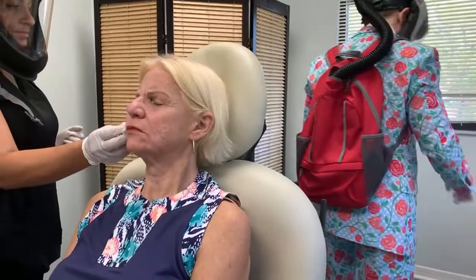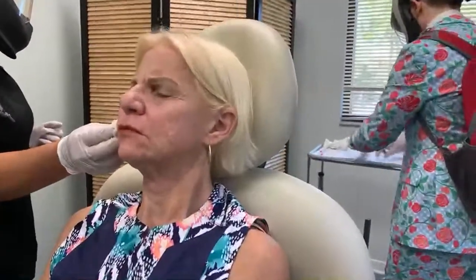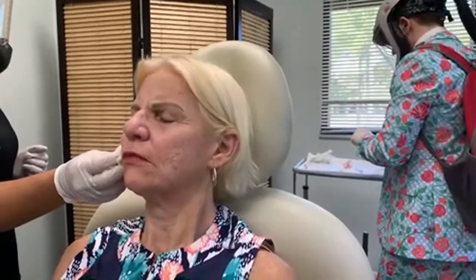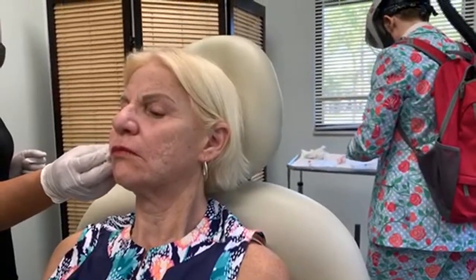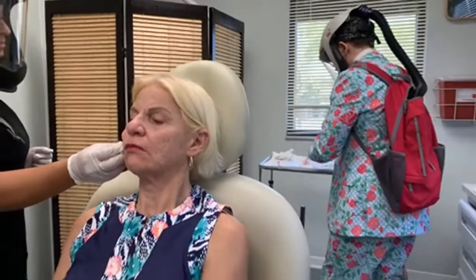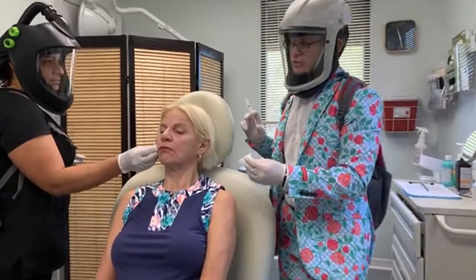And I'm going to grab one more of mine. So we're using Bellafill today for treating this. It's a similar technique to acne scarring. If I get my needle clogged, then I will clear it out, or just replace the needle. So when we see the results back in a couple of months, if we're happy, we leave things be. But if we want to add more, we can always add more. Better to come back another day and do more rather than go too far.